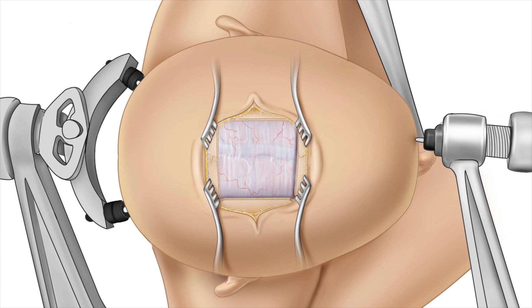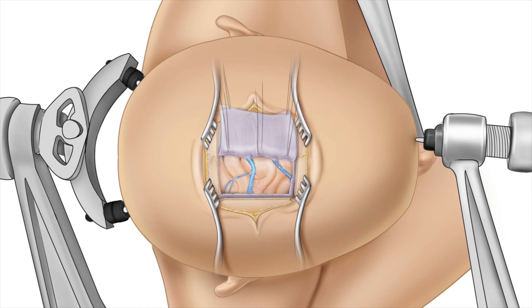Now that the dura has been exposed, we plan our dural opening to allow access to the interhemispheric corridor. The dura is opened in a C-shaped fashion, with its base at the approximate location of the superior sagittal sinus. Once the dura is opened, it's tacked up using multiple sutures.